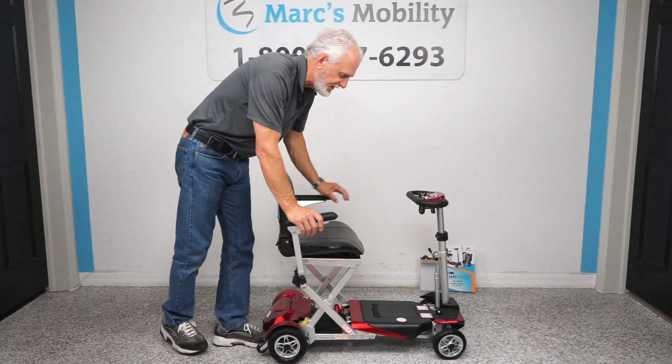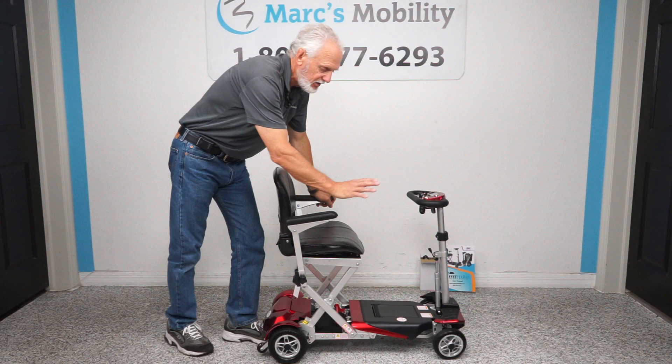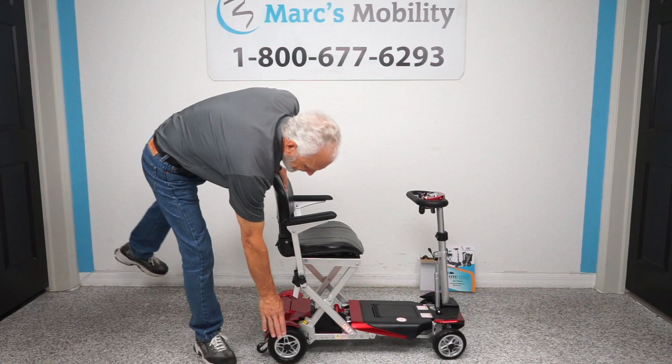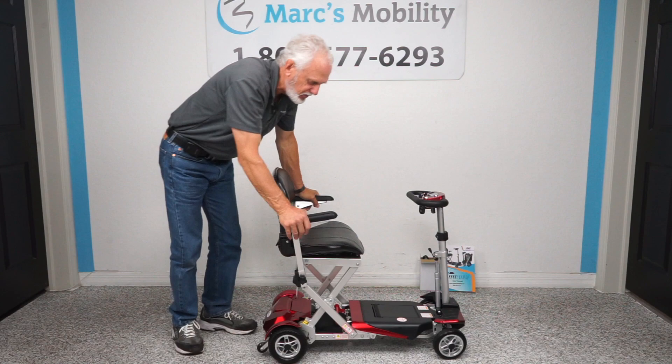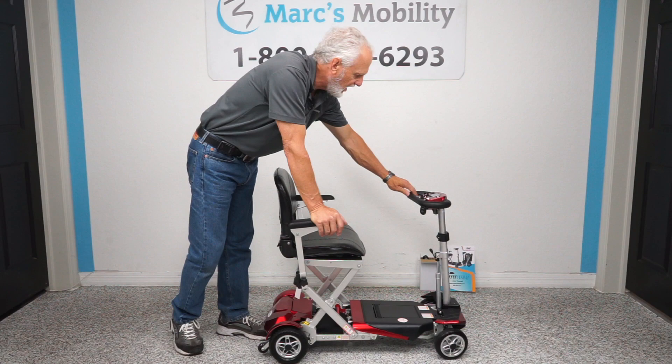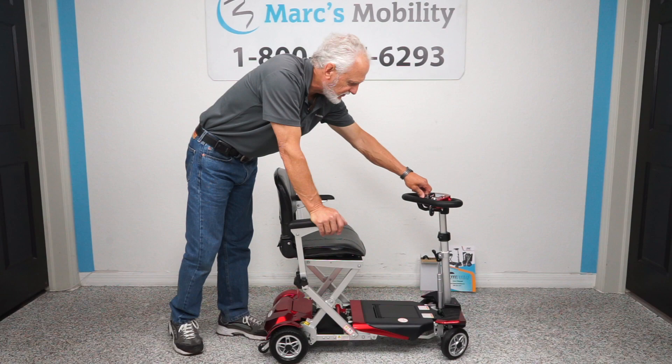You have an adjustable tiller, which is adjustable front to back as well — so if someone wants it closer, you can adjust it. The weight capability is 300 pounds. The total distance on the battery charge on this lithium battery is up to 13.5 miles. It has a top speed of about 3.7 to 3.8 miles an hour. The front wheels are solid — 6 inch by about 1.5 inch — and the back are 7 inch by 2.5 inch. You have a neutral lever in the back and suspension. You also have a digital display showing your speed and battery gauge, and a headlight.